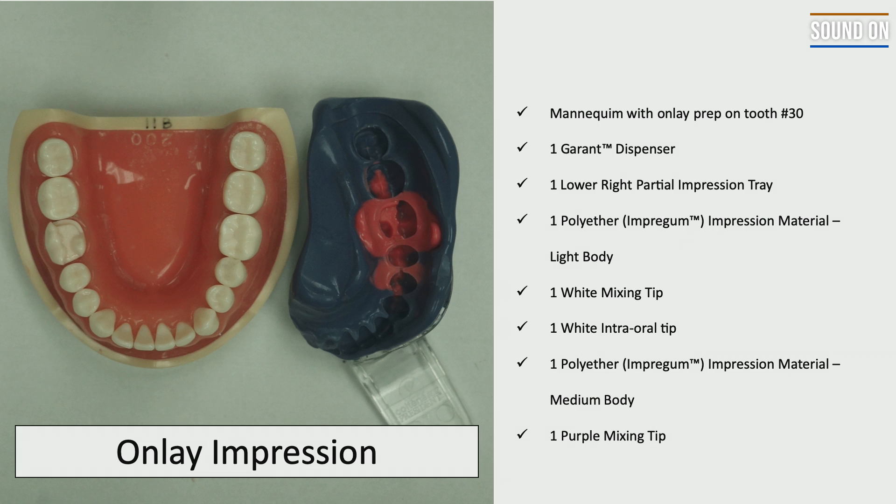For that exercise, you're going to need a mannequin with onlay prep on tooth number 30, the dispenser to use the polyether material. You're also going to need a lower right partial impression tray and two different types of polyether: the polyether in the light body with the white mixing tip and the white intraoral tip, and also the polyether in the medium body or medium viscosity with the purple mixing tip. That material is going to be used on the tray.